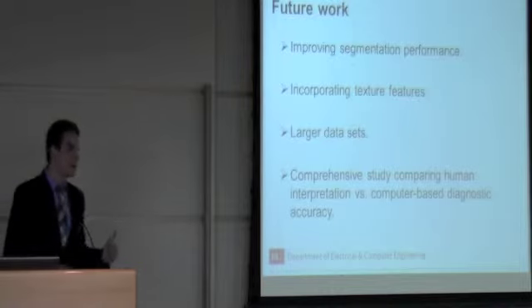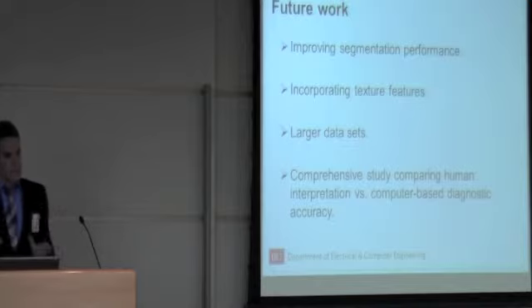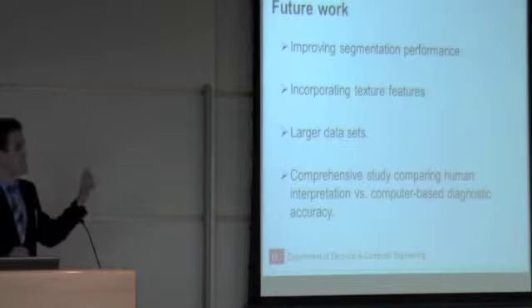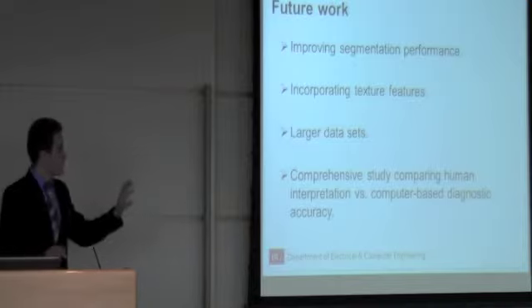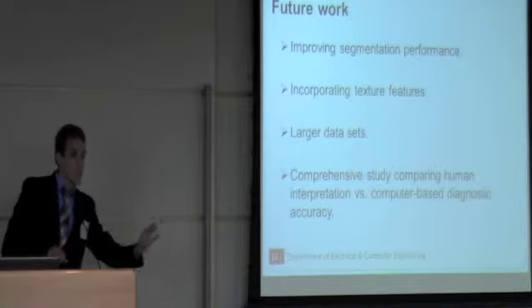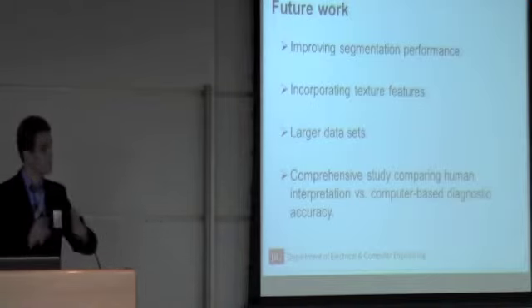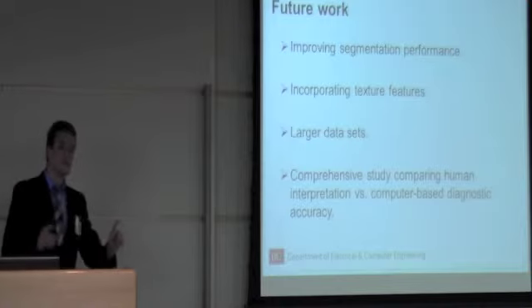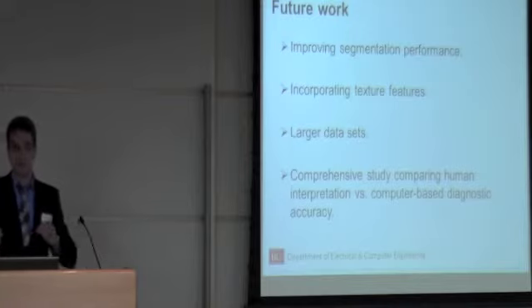Such a study would involve a large number of patients, real-time diagnosis of PCLE images by a physician, and then presenting the same images that the physician diagnosed in real time to a computer-based classifier. That's a fair game. And then, once you have the statistics, you could argue about the computer-based classification being worse or better.